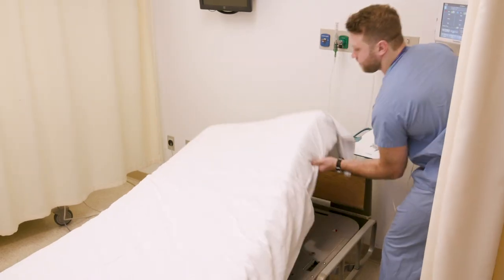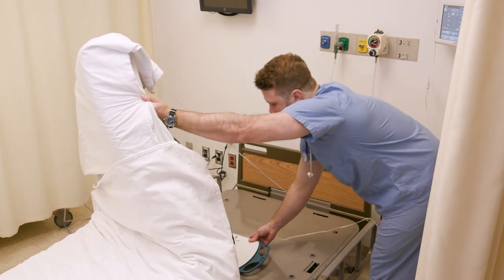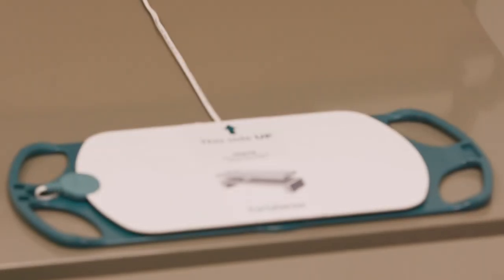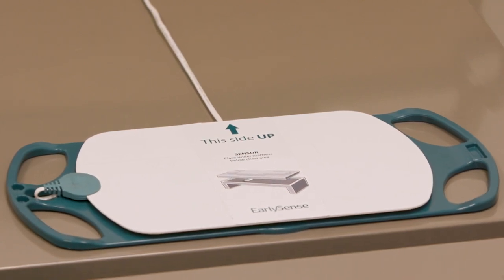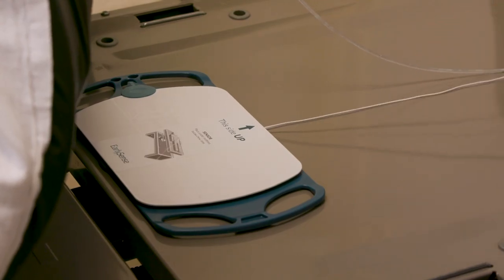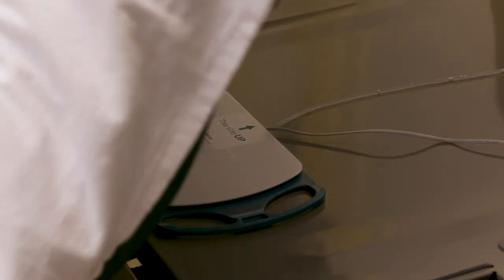Place the sensor underneath the mattress below the chest area. The sensor should be placed horizontally and face up, as indicated on the sticker, with the cable facing towards the patient's head. Secure the sensor cord to avoid the patient stumbling over the sensor.